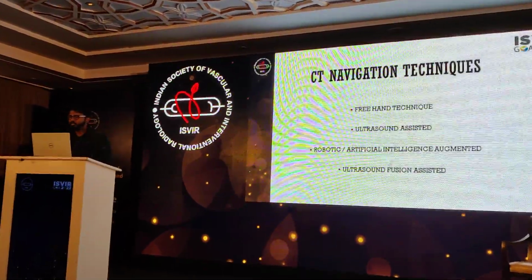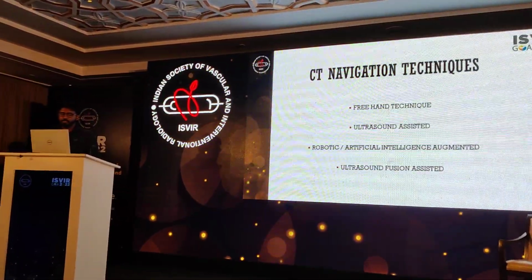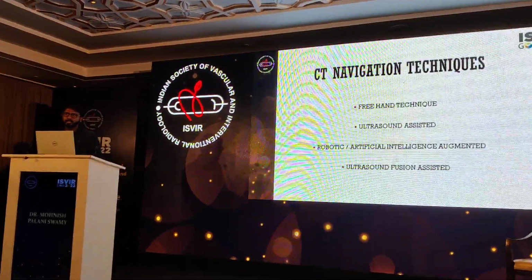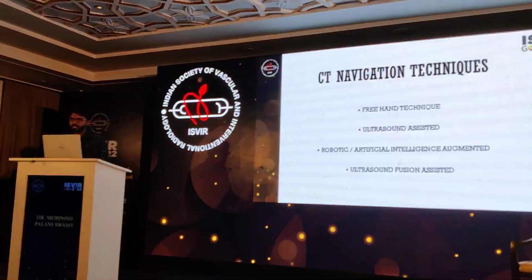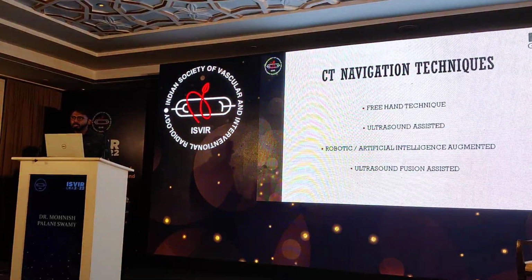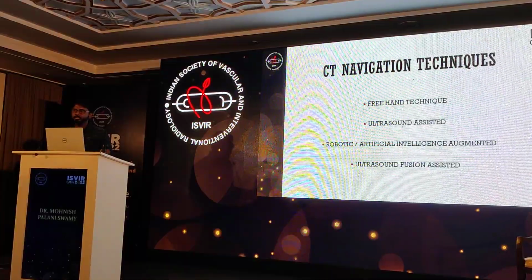Talking about CT navigation techniques, usually most interventional radiologists follow the freehand technique, which everyone is comfortable with, and it has a slow learning curve. But once you start using freehand techniques, our learning curve stops there. We do not think about how to incorporate newer techniques into it.